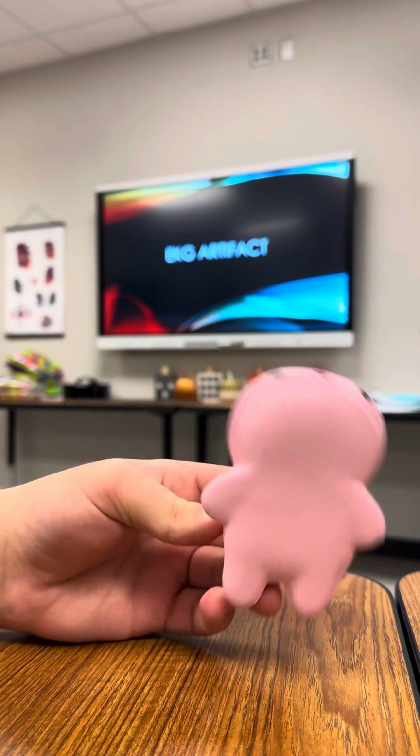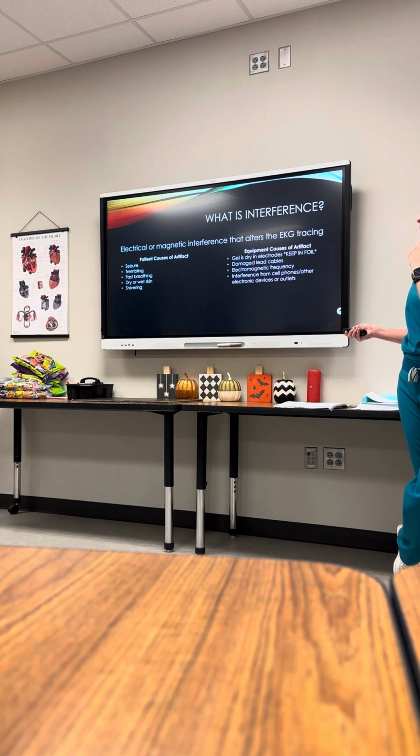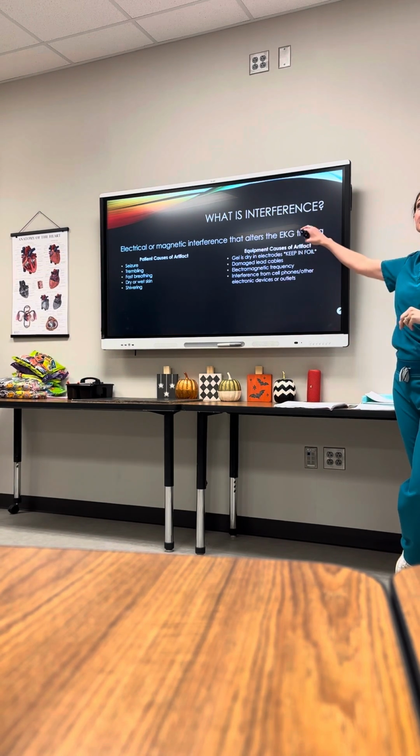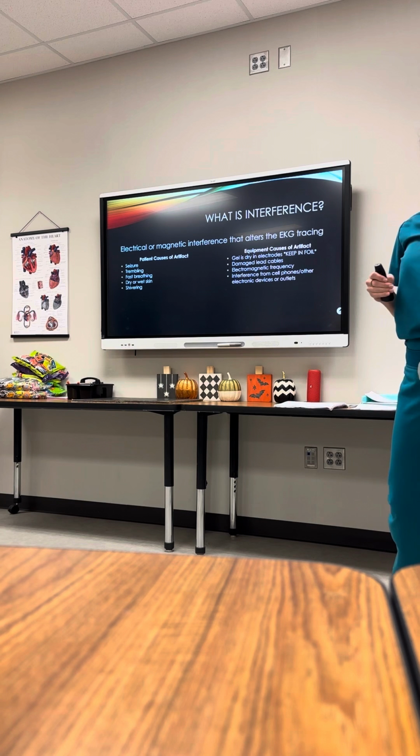All right, we're locking back in now. First of all, let's define what artifact is. Another word for artifact: interference. It is electrical or magnetic interference that alters the EKG tracings.